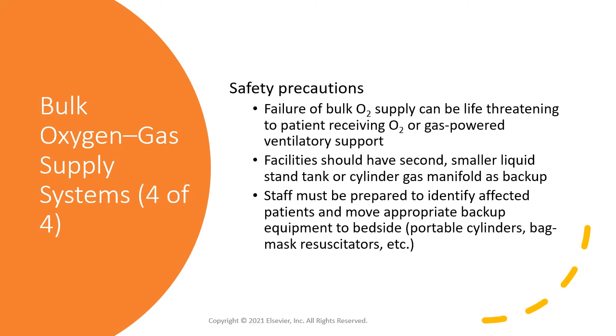Safety precautions. The National Fire Protection Agency sets standards for the design, construction, placement, and use of bulk oxygen supply systems. A key provision in these standards is a requirement of a reserve or backup gas supply to equal the average daily gas usage of the hospital or facility.